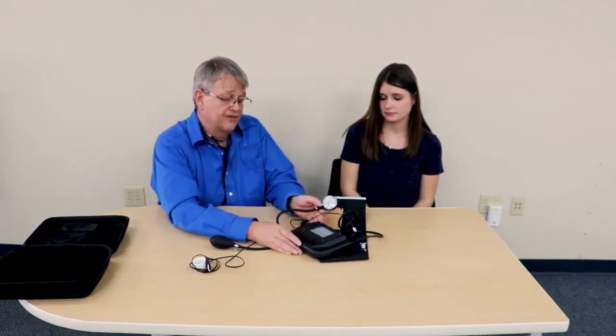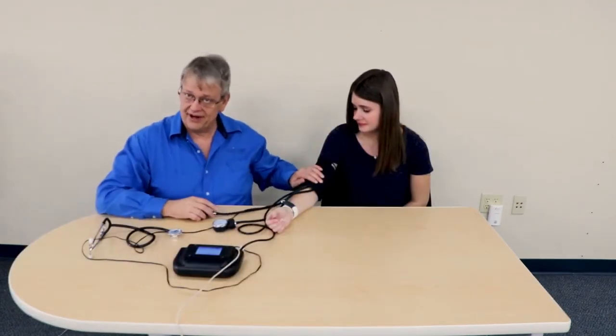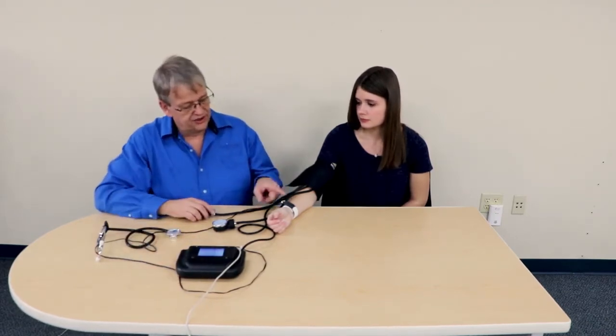I press the main menu button and go directly into the test screen. Place the arm band onto the subject or mannequin and place the pulse band on to demonstrate some sounds. I have an amplified speaker connected to the unit through the headset port with a standard 3.5mm audio connector. You can feel for a pulse right now — it will persist until you pump up above systolic. I'm going to start pumping up so I no longer feel a pulse, then lower it at about 2.5 mmHg per second.